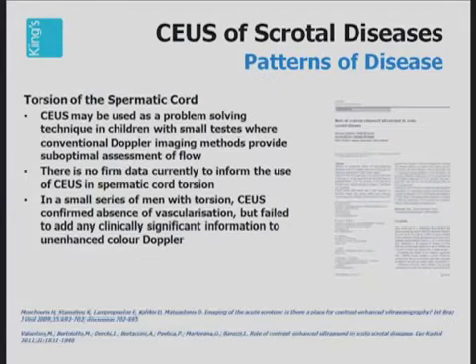Now, there are certain recommendations for the use of contrast-enhanced ultrasound in scrotal diseases, and I am going to demonstrate to you in the next few slides the data that is available and published in the European Federation's guidelines to the use of contrast in scrotal diseases. First of all, let's look at the torsion of the spermatic cord.